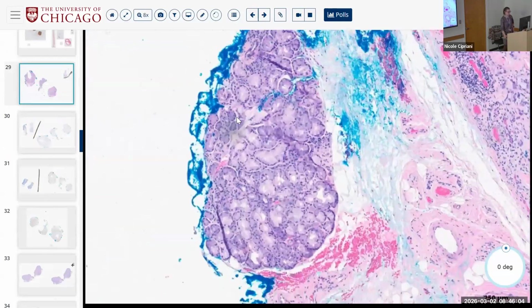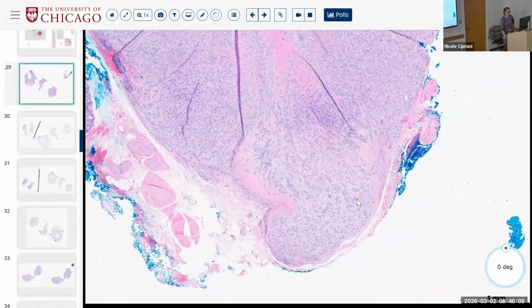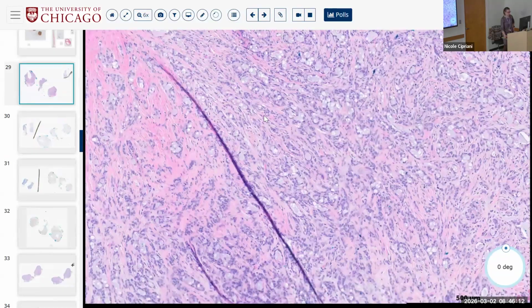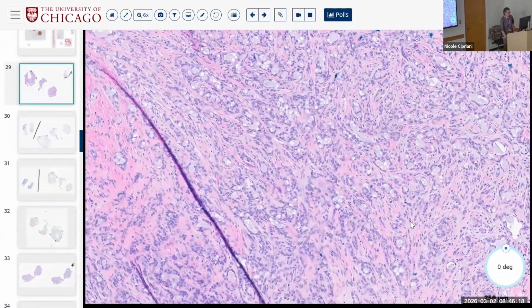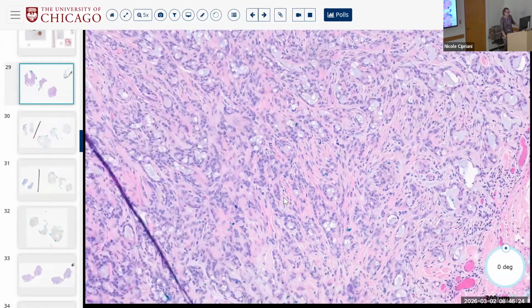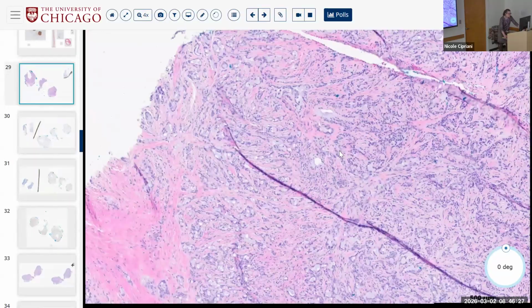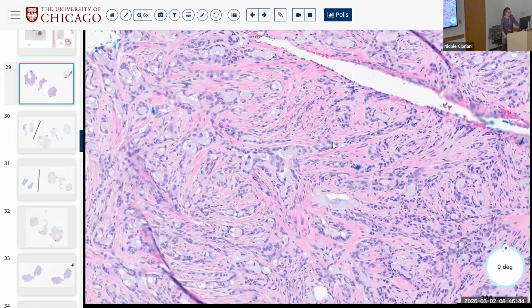Next. We have a little salivary tumor here, maybe kind of mixed seromucinous. Again a circumscribed thing with this microcystic pattern. What do you notice that's different? The stroma. The stroma is very spindled in the background, which we haven't really seen yet. So now we have this almost secretory-like pattern, but with this fibrocellular stroma in the background, which is kind of interesting. Just keep that in your mind.